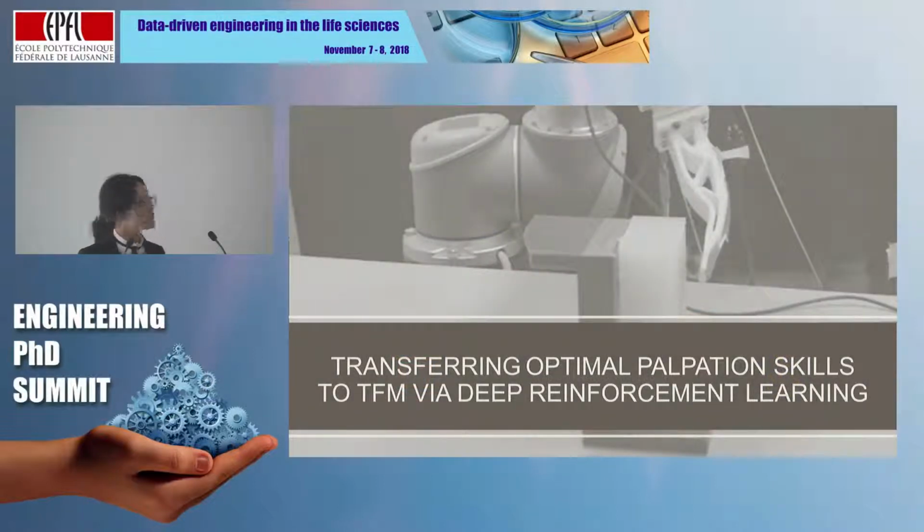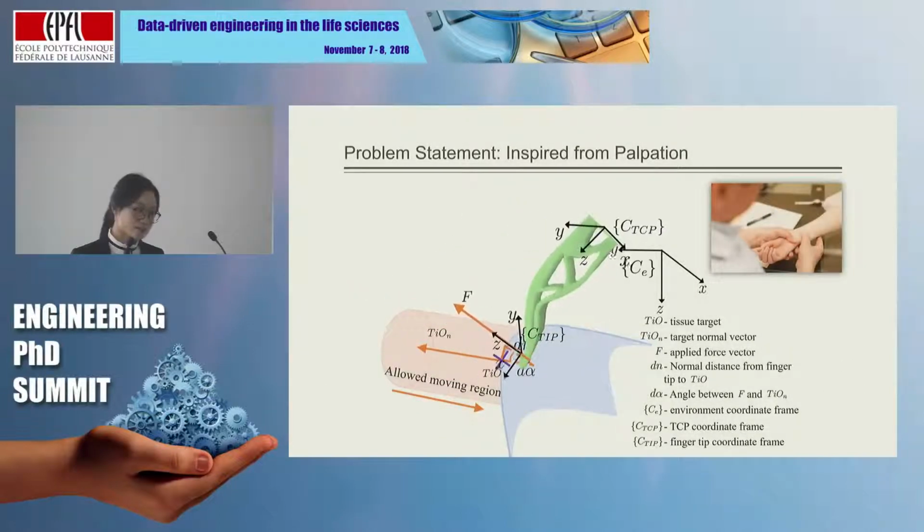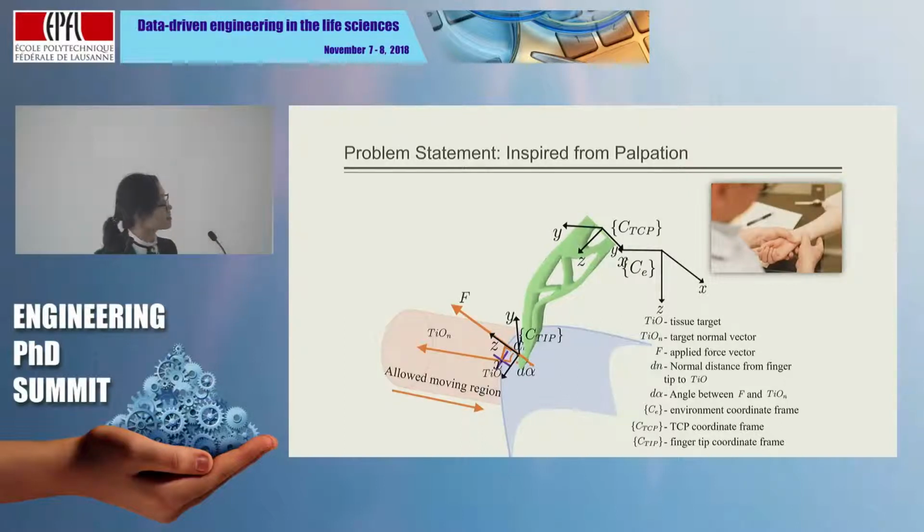Okay. The previous study only considered trajectory properties, but for surgical manipulators, interacting with or manipulating soft tissue objects is almost inevitable. So a framework that also considers force requirements is proposed here, enabled by reinforcement learning. The task is palpation, where we aim to automate a crucial step: the robot taps the tissue, establishes contact with the tissue in a confined region, and applies a gentle force to the tissue.